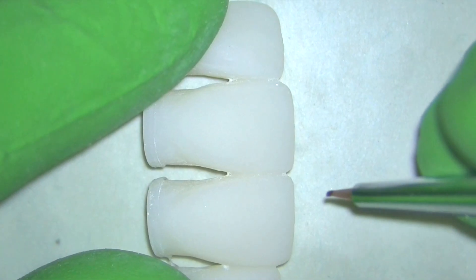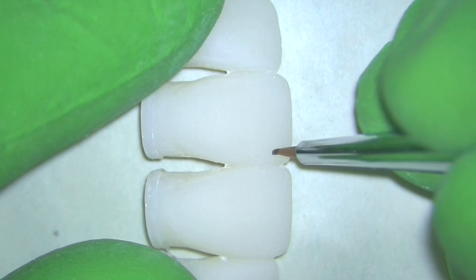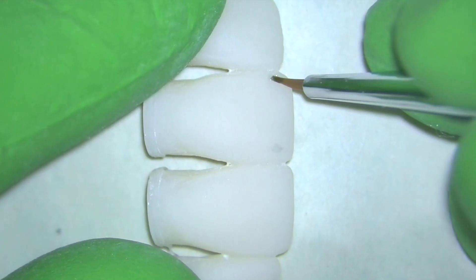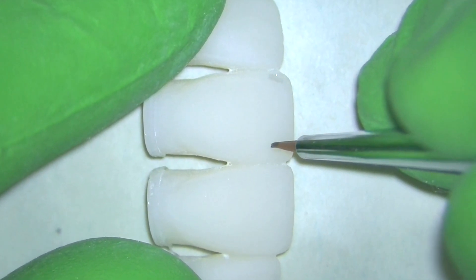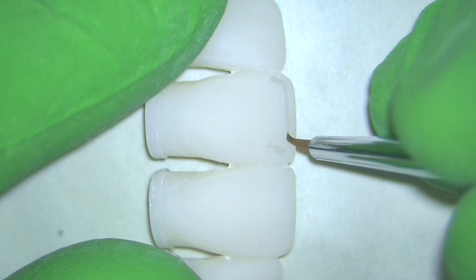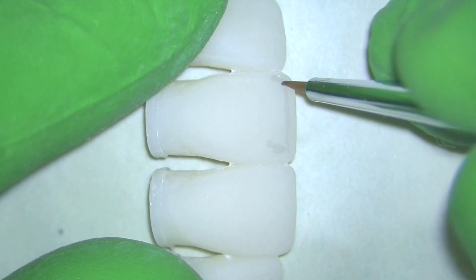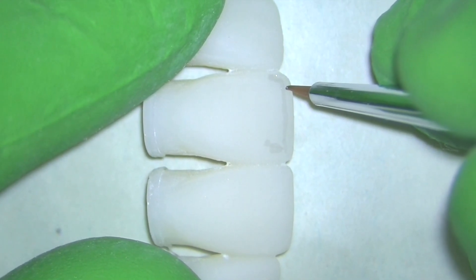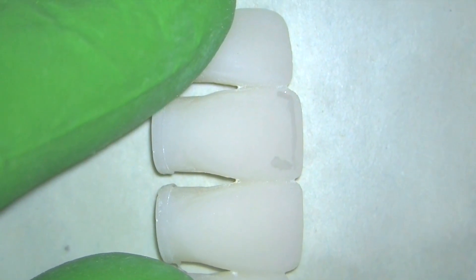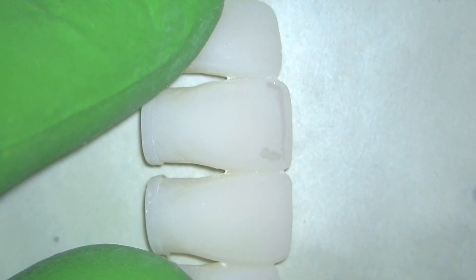I'm using the OptiGlaze kit here, and the first thing I'm going to do is add some gray. I'm using a really fine brush, and as I dip my brush in that gray I'm going to add it onto the tooth in two points, and then I'm just going to take the additional glaze and work it right along just below the incisal edge to start adding some translucency. As I go back and start working on the other central I'm going to do the exact same thing.